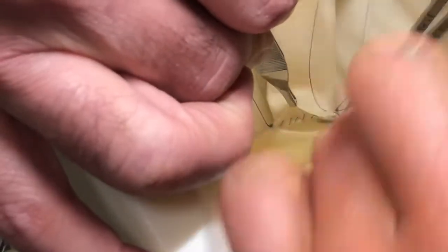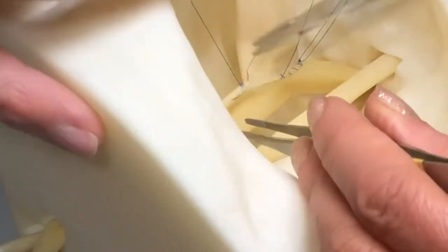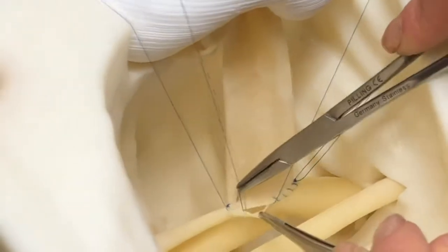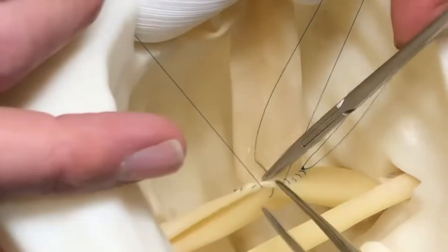In order to complete the anastomosis, we run to the midpoint of the suture line and then transition back to our stay suture in order to tie the knot in the middle of the anastomosis.